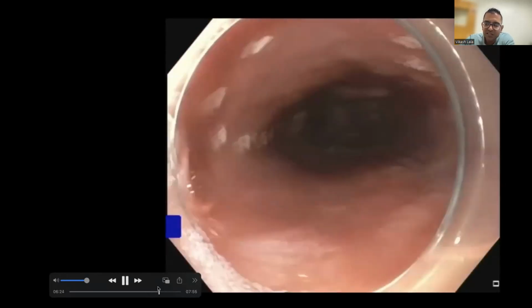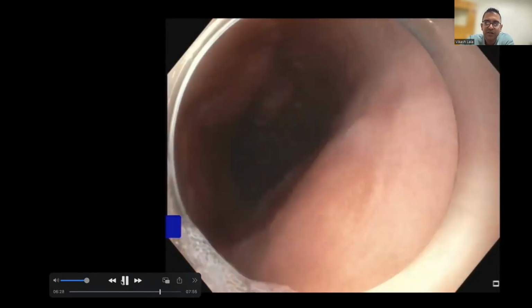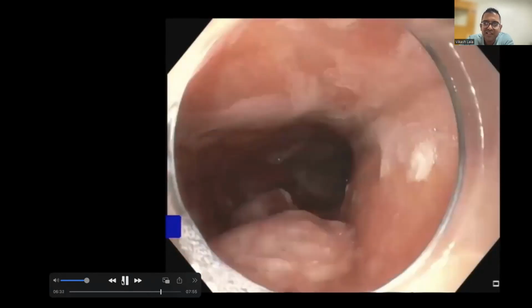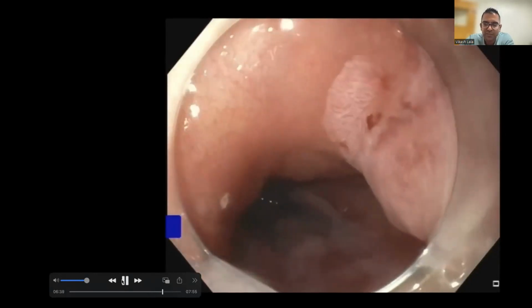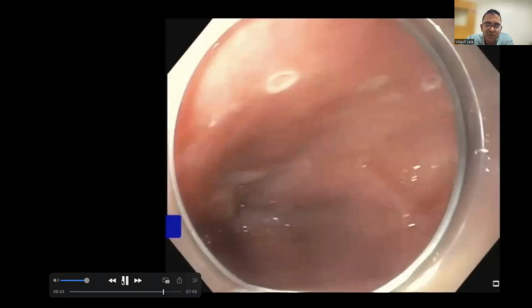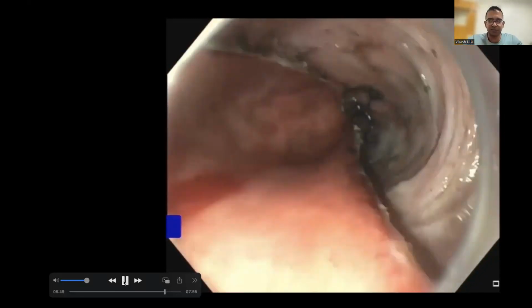So what I proceeded to do was an ESD for this patient. I went very wide. These are my markings. So this is where I cut along when I was performing the ESD. So I went nice and wide to include those nodules and to include that area of what I believed was high-grade dysplasia orally or proximally or whatever you want to call it above those nodules. So you can see my markings nice and wide around the nodules, including any areas of visible high-grade dysplasia, which I picked up or felt I picked up endoscopically.